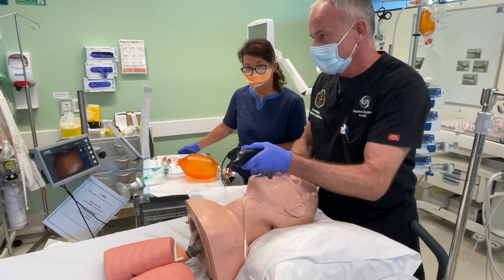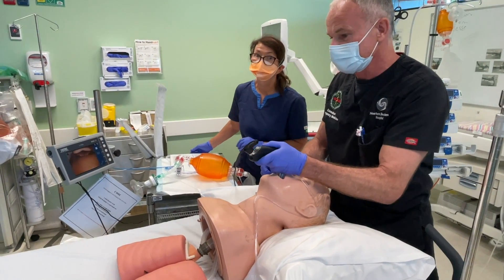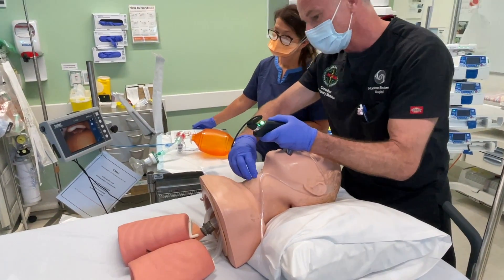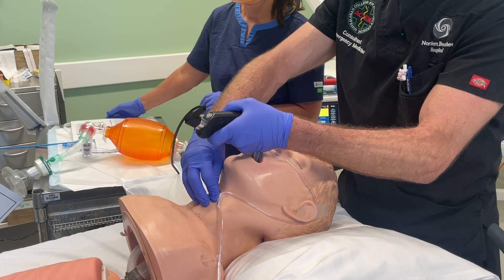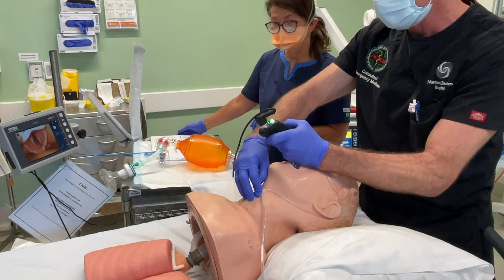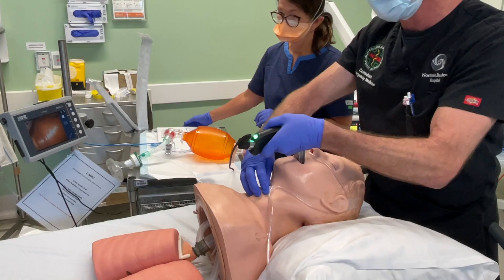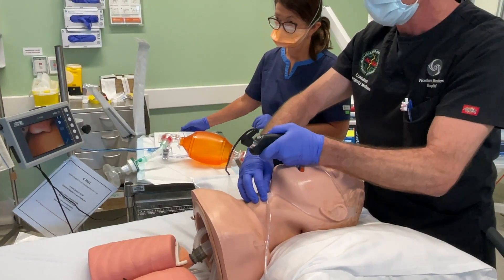The first thing is to try and improve purchase in the vallecula to lift that epiglottis. We would do external laryngeal manipulation, putting pressure on the thyroid cartilage to try and improve the position of the tip of the blade into the vallecula, and that will then get better lift of the epiglottis. Once that happens, I can then let go with my right hand. External laryngeal manipulation, also known as bimanual laryngoscopy, to improve purchase of the tip of the blade into the vallecula.